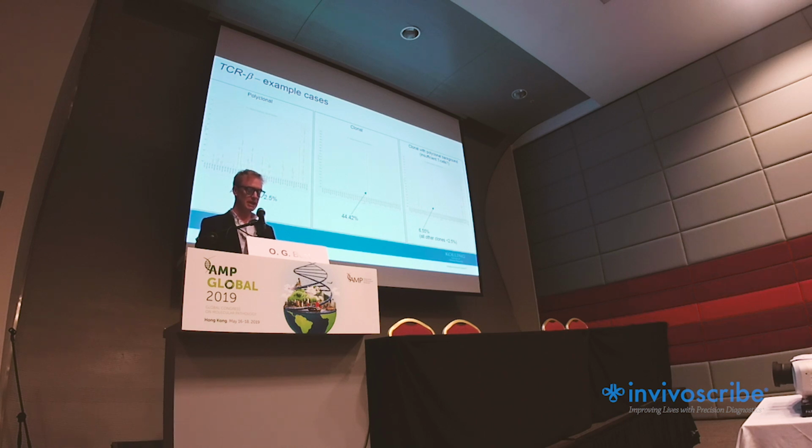Now, we've heard yesterday from Dr. Bob where the actual sampling is probably very important, and as we're sort of unsure why this result looks how it does, but it was a clonal sequence, but there's a possibility that there's insufficient actual disease sample within that sample.